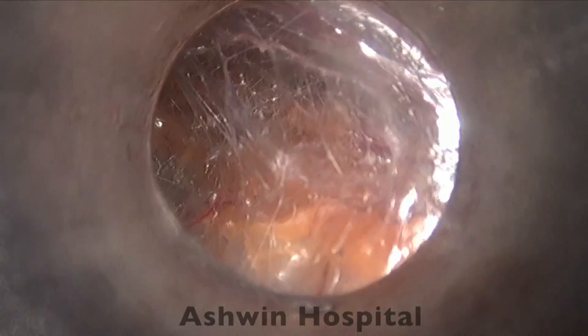So we are trying to enter between the two leaves of the transversalis fascia. Some tips to identify it: one, there shouldn't be any vessels running through the space. Second, the rectus muscle should not be bare. There should be a fascia which is covering it. Once again, you can see we are looking anteriorly, and that is the inferior epigastric vessel which is running.